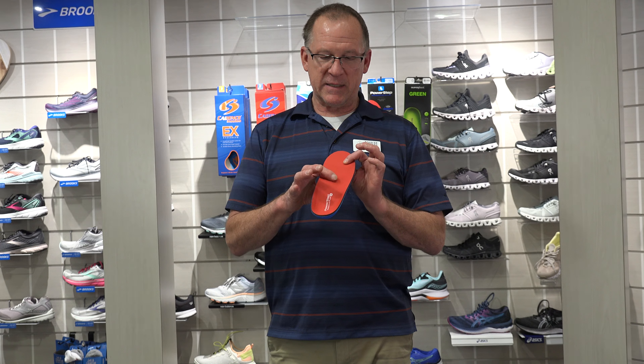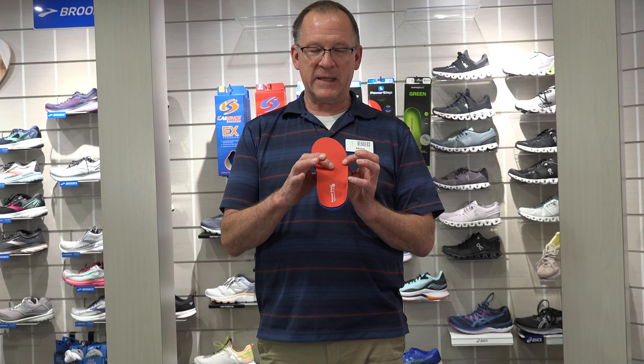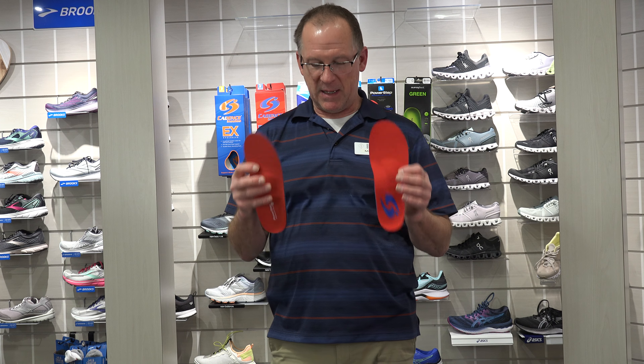The Power Plus by Power Step — the transverse arch is not in the right place. There are a few people who like it, but basically it's in the wrong place. When customers step into Cadence, it's just instant comfort because it's more anatomical — it's the way the foot is shaped.